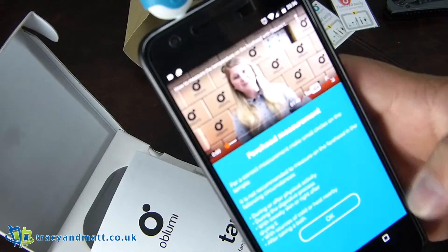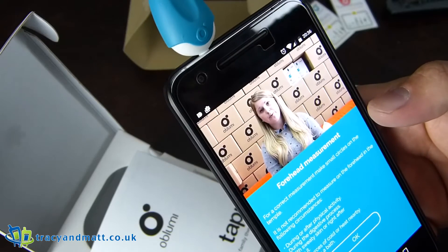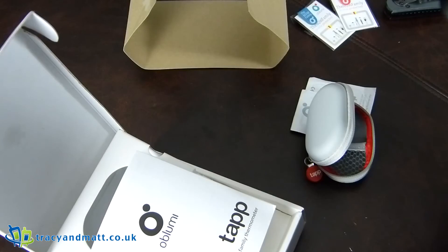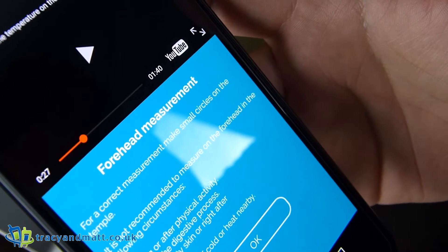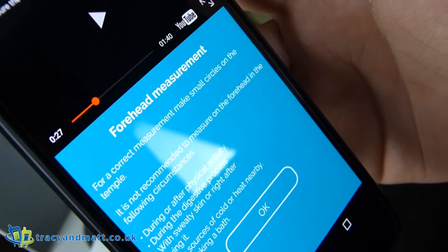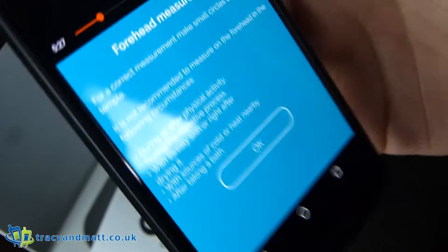We get a little YouTube video. That's a pain — we can't listen to it because the thermometer is in the 3.5mm headphone jack, so the phone has detected that the headphone jack is in operation. I'm sure there's a way to turn that off to use the front speakers, however I couldn't see it immediately. So we'll rely on the text. It says for correct measurement, make small circles on the temple. It is not recommended to measure on the forehead during or after physical activity, during the digestive process, with sweaty skin, right after drying it, with sources of cold or heat nearby, or after taking a bath. Fairly obvious stuff.